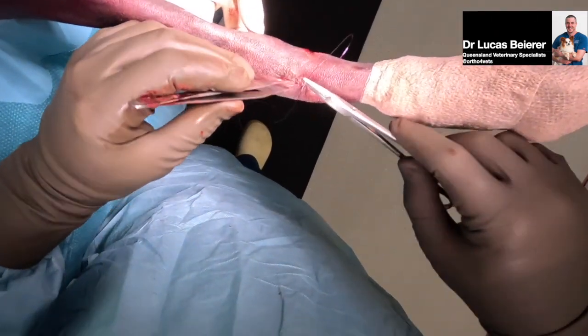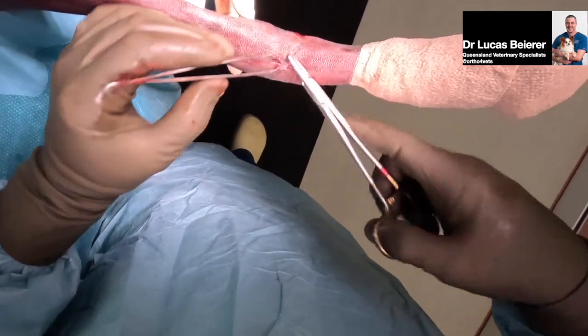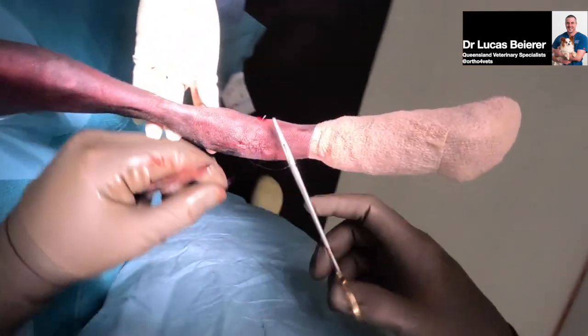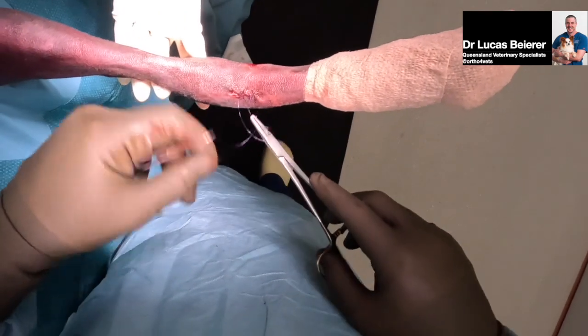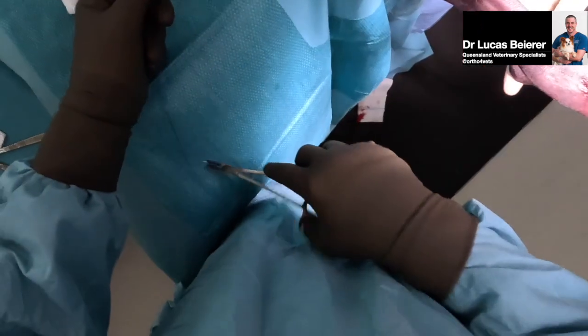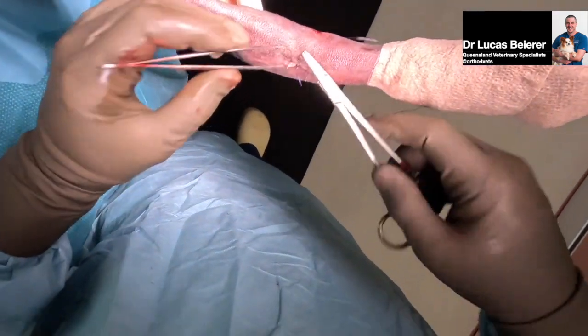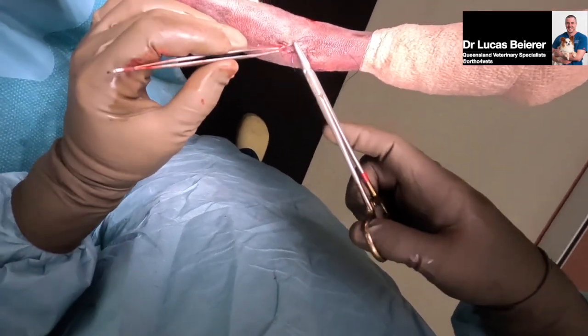But I don't think we need to place a plate over this, because we're going to get an effective fixation on the lateral side, hopefully. You see this dog's already got excoriations simply from the pressure that's building up, kind of post-trauma. So they're beautiful dogs, but they're absolutely abysmal when it comes to soft tissues.